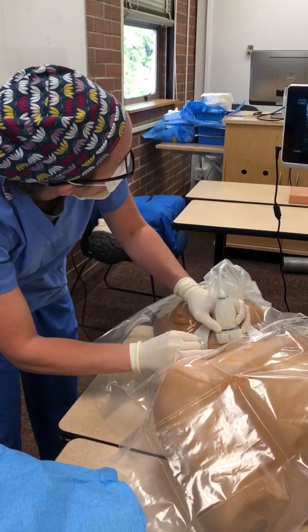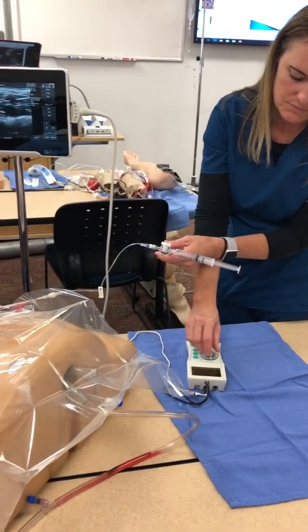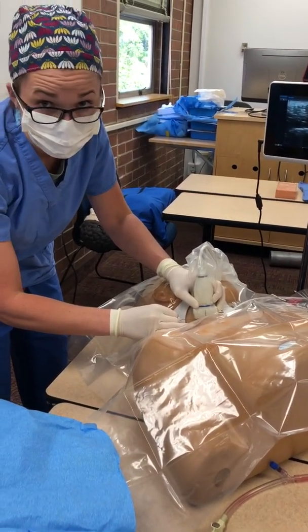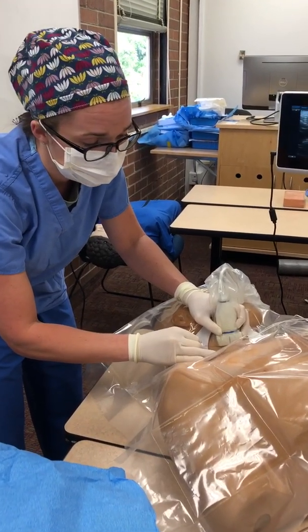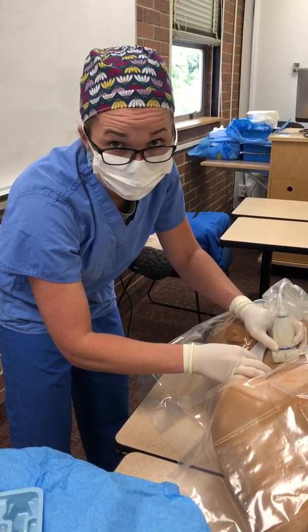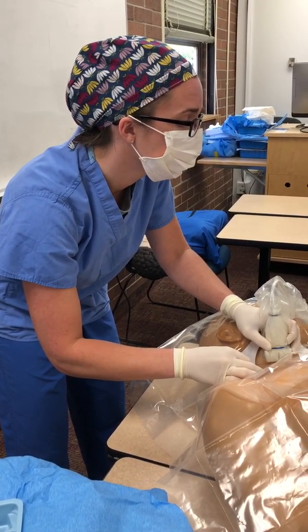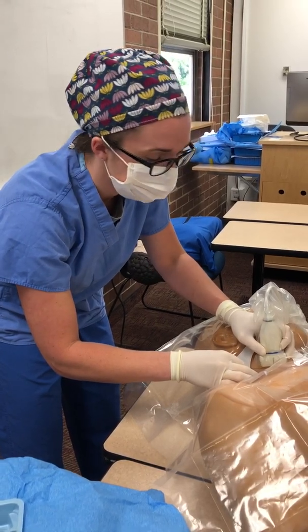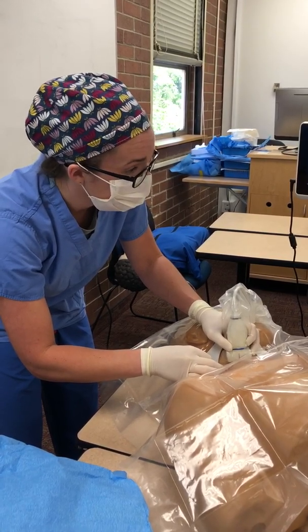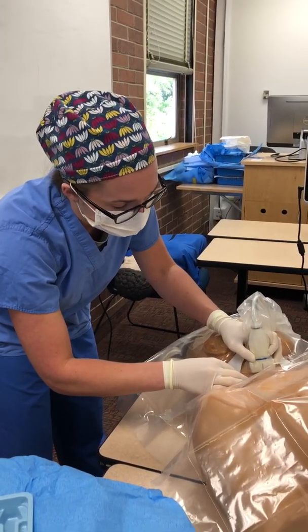So again, once I saw that it was nice and close to the nerve, I'd have my assistant turn on the nerve stimulator. And we could start at just like 0.3. Okay. So at that point, since I can see that I'm that close to the nerve, I should see a twitch, either in the deltoid, the bicep, the forearm, somewhere in that area. If I didn't, I would know that I need to advance a little bit closer. So now I'm going to have you turn it down to 0.2. 0.24, 0.20. Okay. And at this point, I should have lost that twitch. So I'll have you turn it back up to 0.3. If I hadn't, I would know I was too far into the nerve. I need to back up a little bit. We're at 0.3. So at 0.3, I've reestablished the twitch.